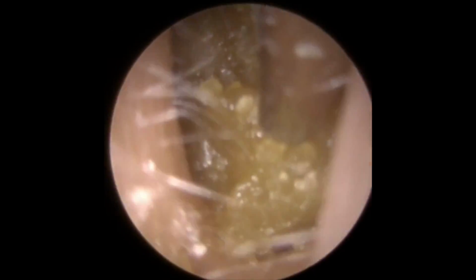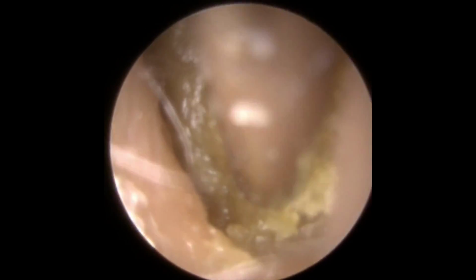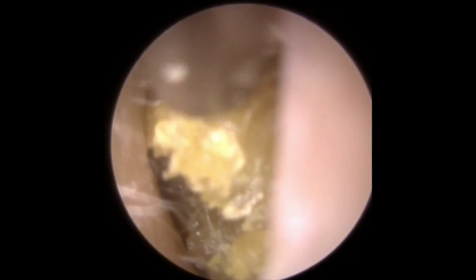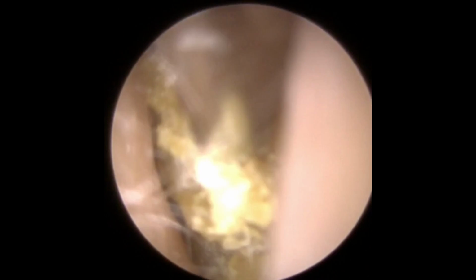Working on any looser parts I can see. You can see just trying to break this chunk away. There, just try to turn it again. We're moving it down from the right to the left and then pulling it down from the top as well. We've got a bit of a ledge here, so I'm hoping this is going to snap off, which is just starting to there. So that gets another chunk off this wax.